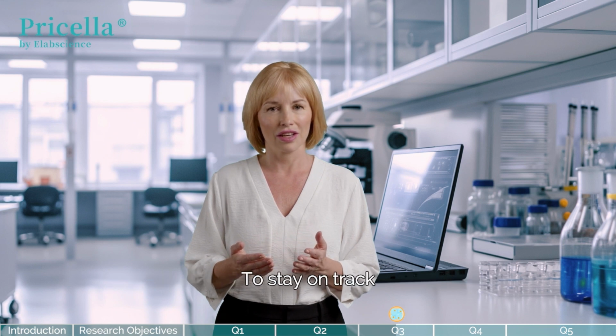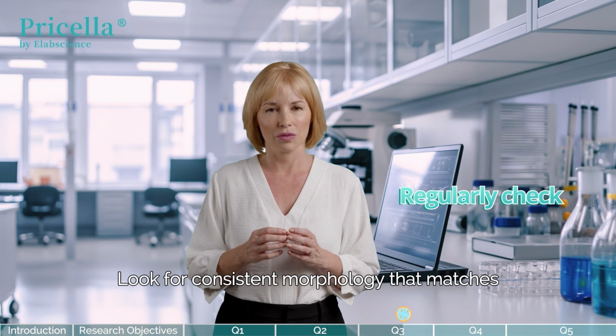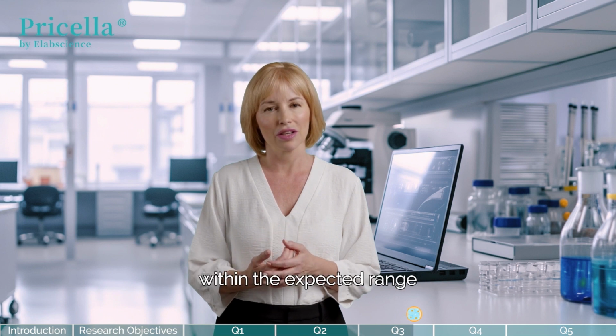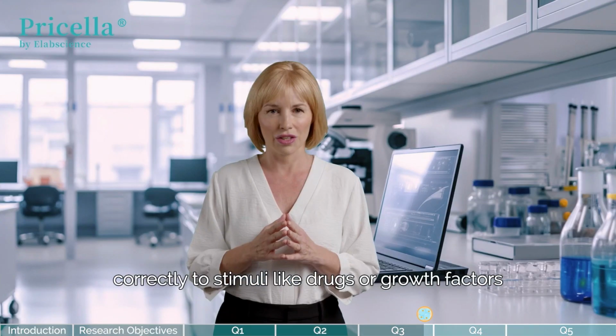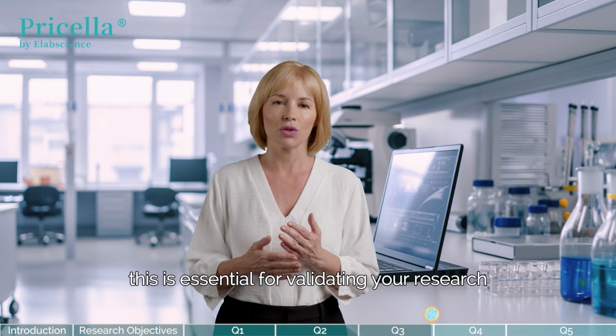To stay on track, regularly observe your cells under a microscope. Look for consistent morphology that matches what's described in the literature. Check that the doubling time falls within the expected range. Running a few preliminary experiments can also help confirm that the cell line responds correctly to stimuli like drugs or growth factors. This is essential for validating your research.